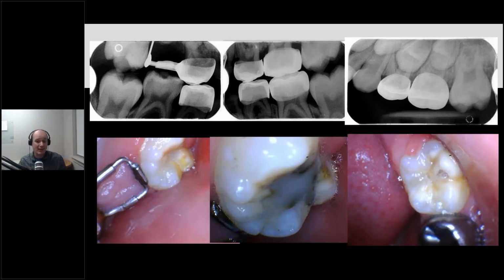And I think that's why these products are so successful: the science behind them, when you look at the study that's done in the lab, I think that's happening in the mouth. And that is why I think it's a way better product for pulp therapy than calcium hydroxide. That's one of my favorite products, the calcium silicates. I would not practice without those.